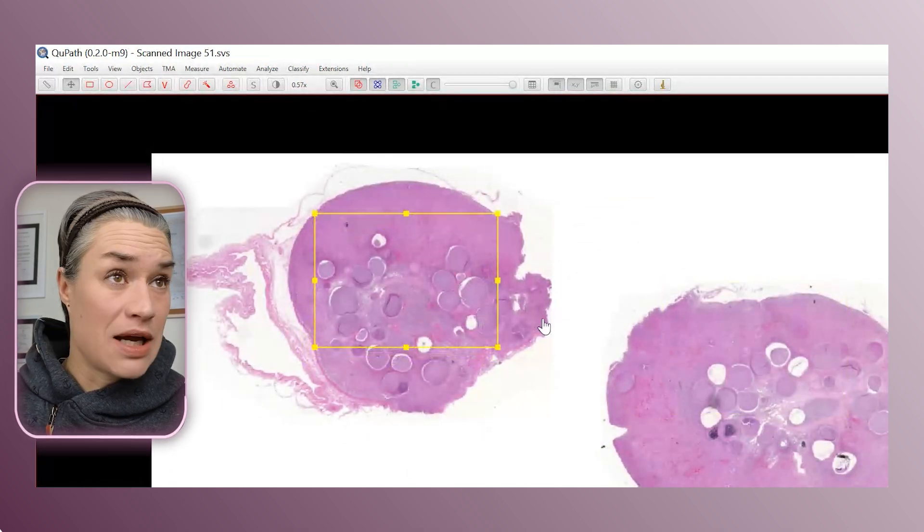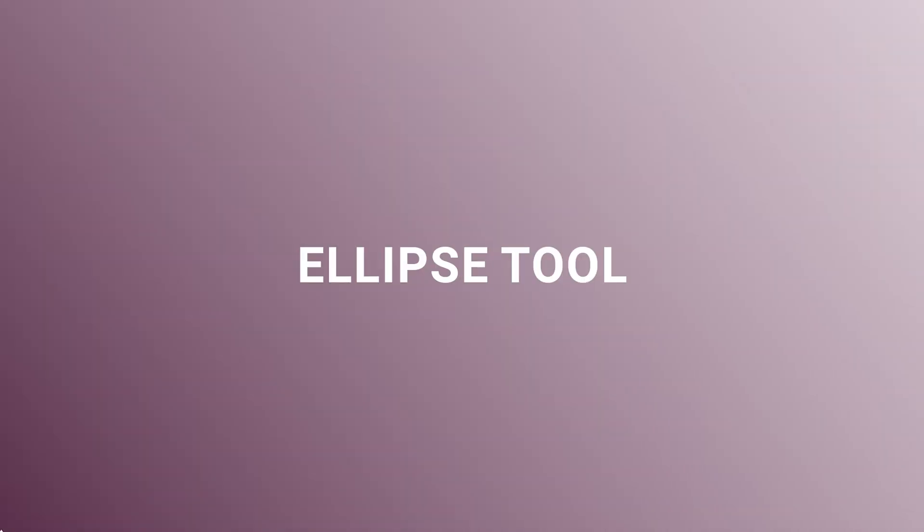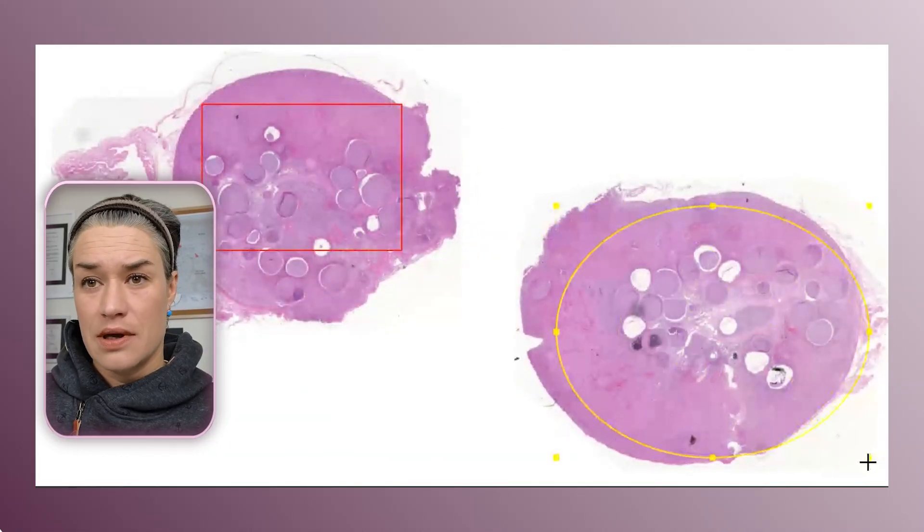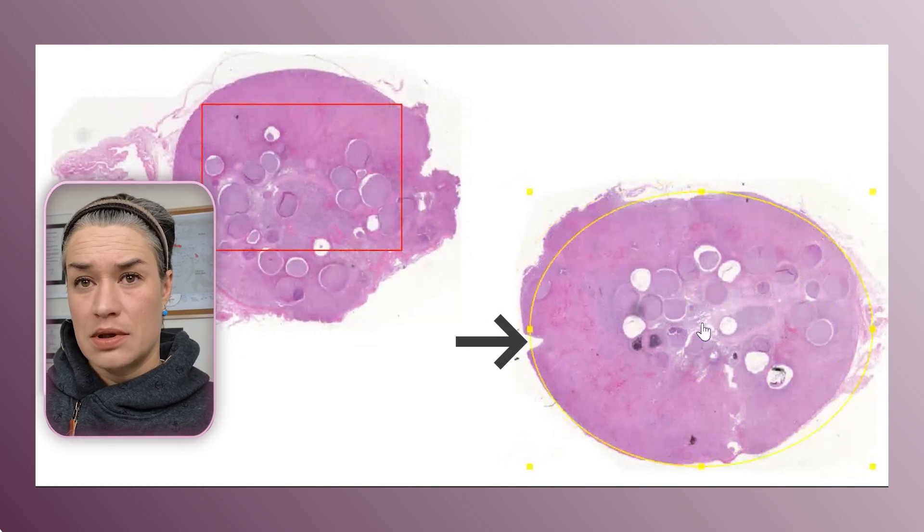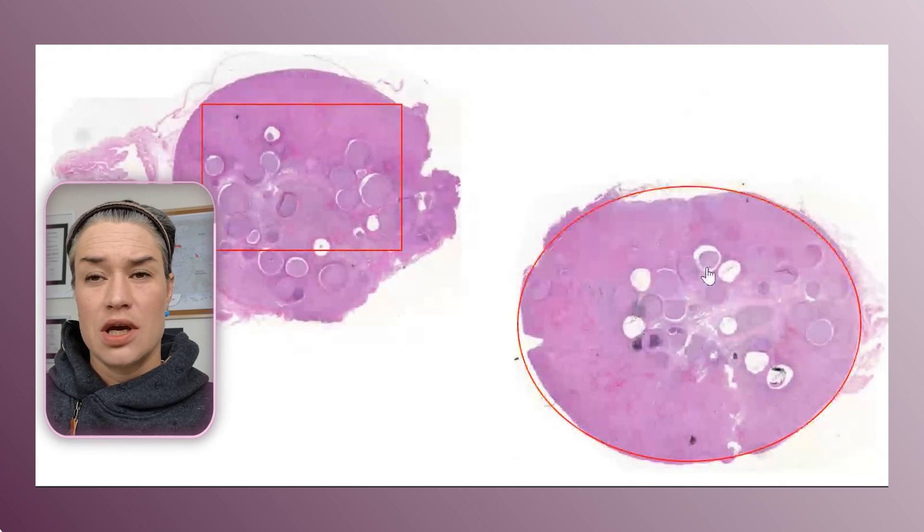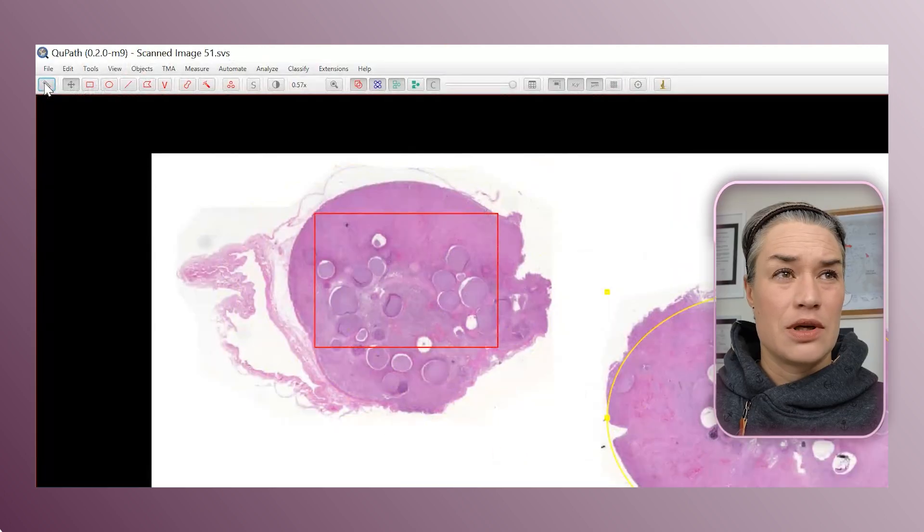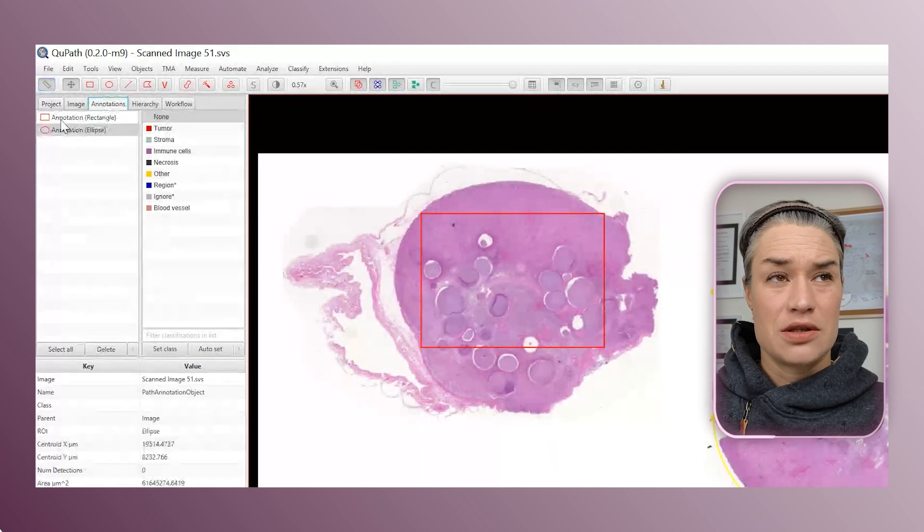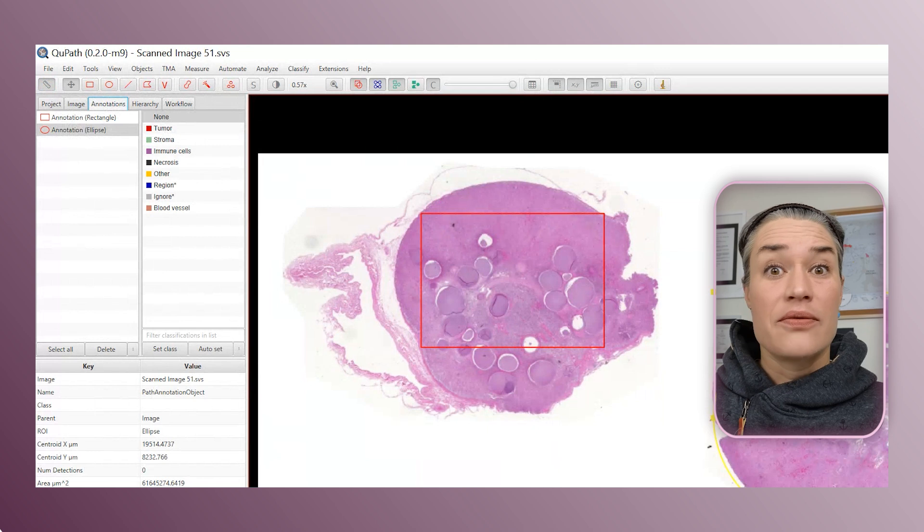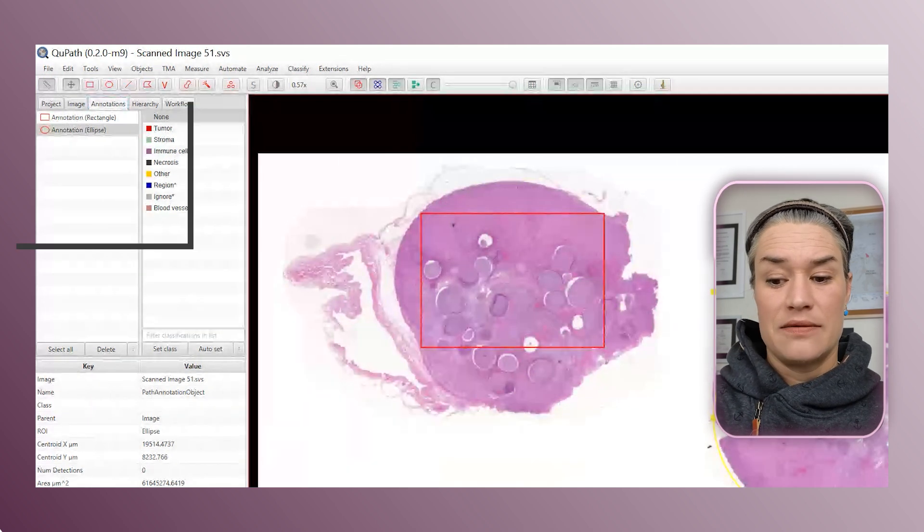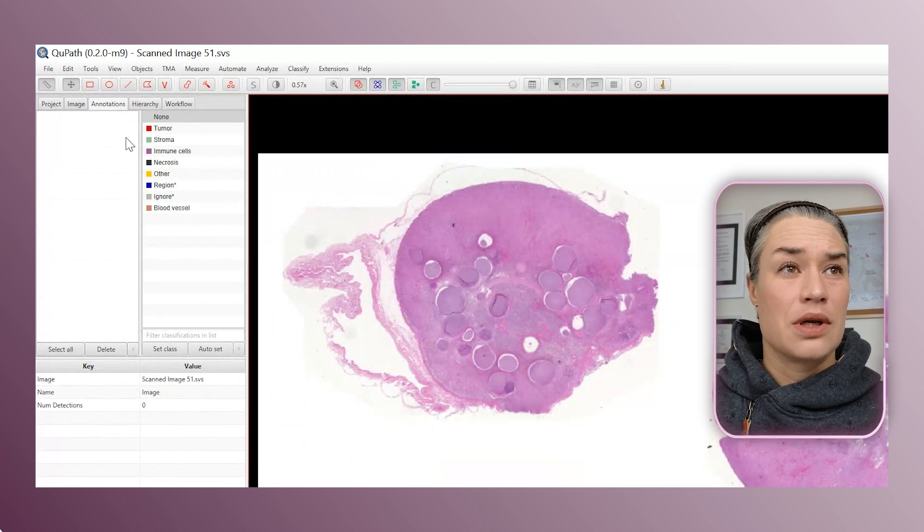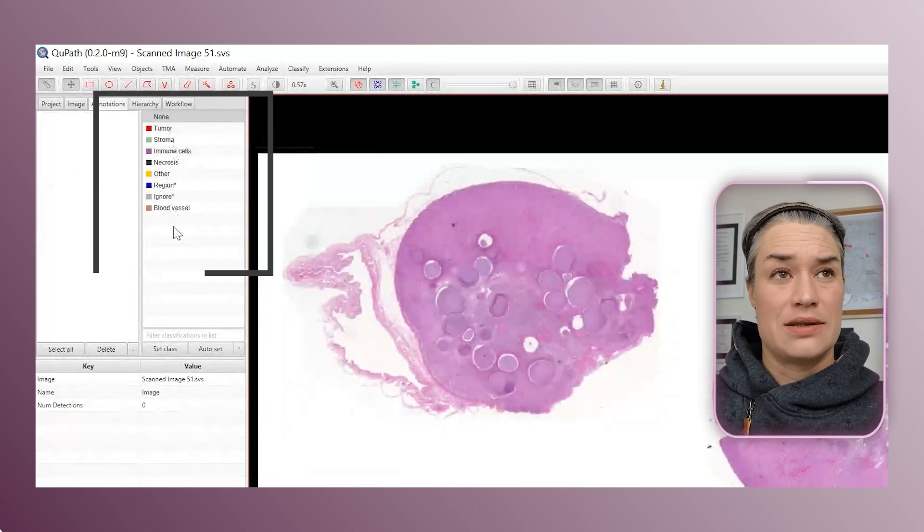The rectangle I don't use it that much, but other people might. The same counts for an ellipse. Our cyst actually has an ellipse shape. Put it inside. Again, double click, it becomes red, you cannot change it. You click inside, you move it. When we open our side panel and check on annotations, we see a list. Annotation rectangle, annotation ellipse. Amazing. If we want to get rid of them, we make them activated and click delete. And they disappear here. And look, here we even have colors for different annotation classes.